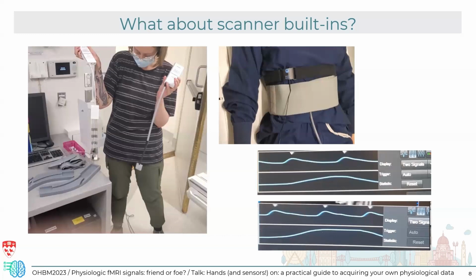for offline analysis. So in these two examples, you can see PPG data in the top row, and it's got little arrows detecting the peak-to-peak statistics. So it'll tell you things like your participant's heart rate in real time. And on the bottom, it has the respiratory waveform. And you can see in general, these curves are very smooth. And in fact, in the very bottom respiratory waveform, there's quite a bit of clipping.